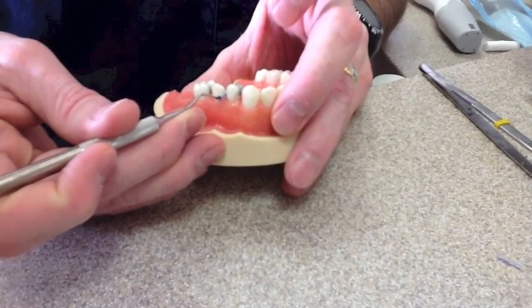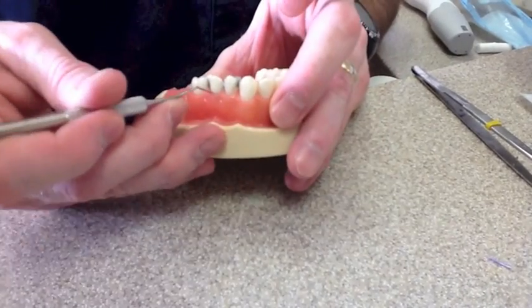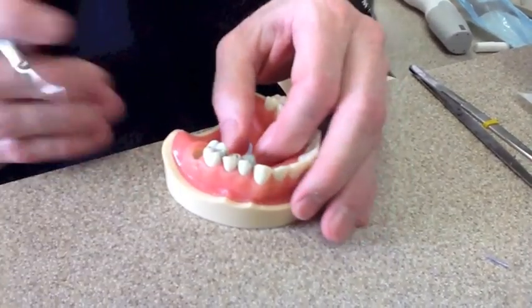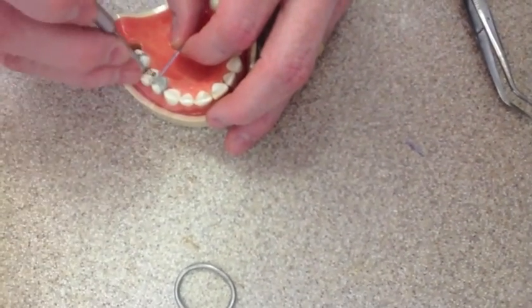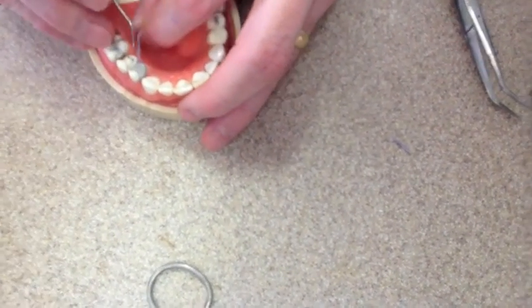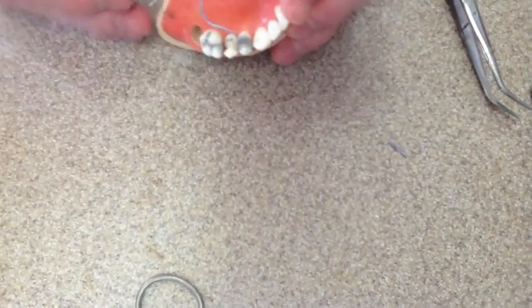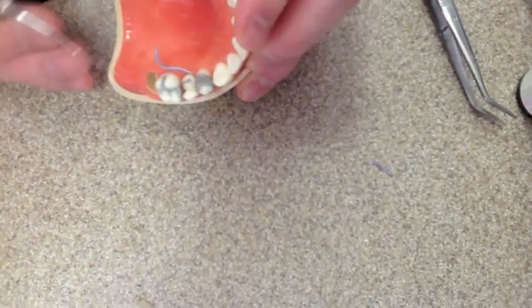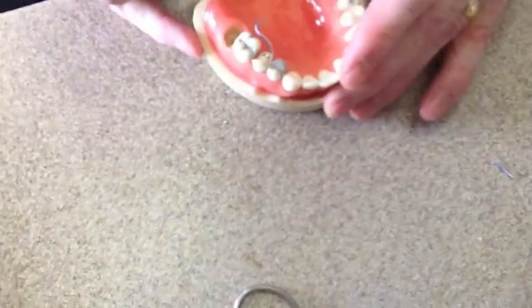Now I'm going to kind of push into that clump and push it the way I'm going. I'm pushing it that way. Okay? And there. Now I'm going to pull it tight. Get on top, cameraman. I'm going to pull it tight and push in there. Pull it tight and push down there. Okay? Now I'm basically through. I'm going to come back through and kind of push again. But I'm basically done. By pulling it tight through the contact, you can get it.